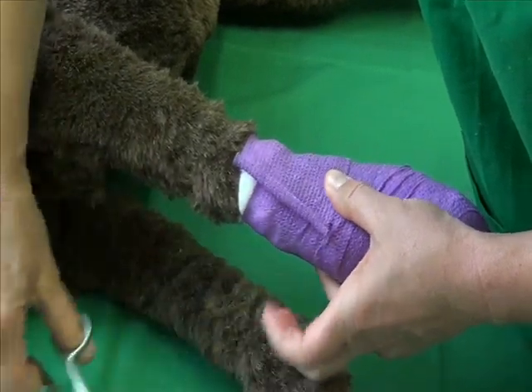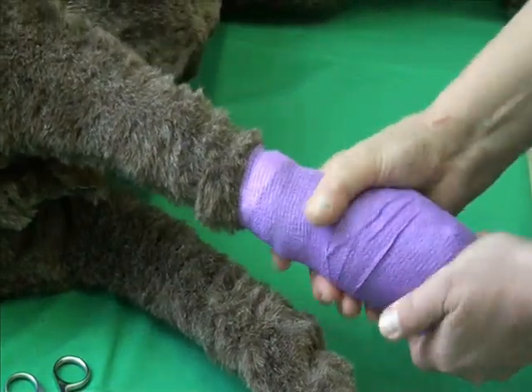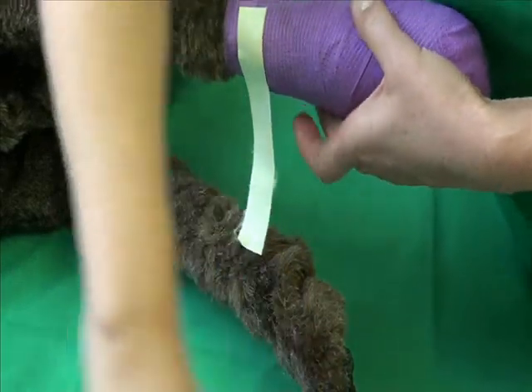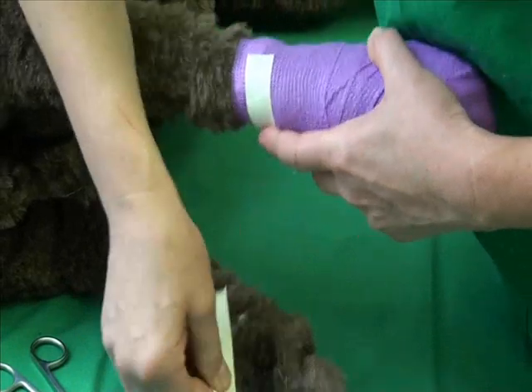It is very important to check the bandage is not too tight to avoid causing serious injury. Secure the bandage with adhesive tape. In cats, tape should not be applied to the skin, as it can cause severe irritation.